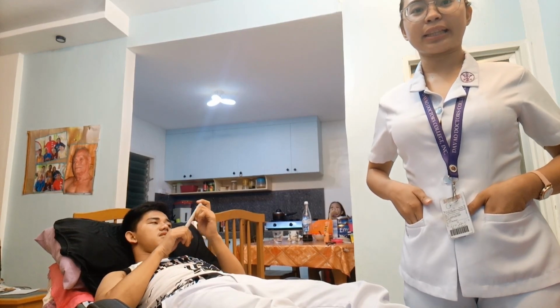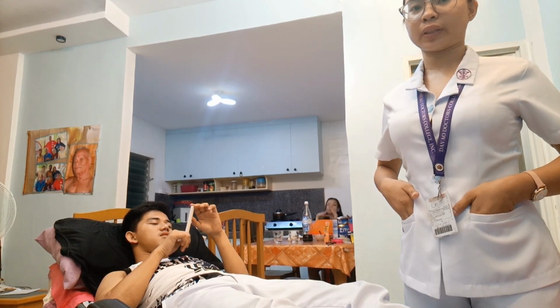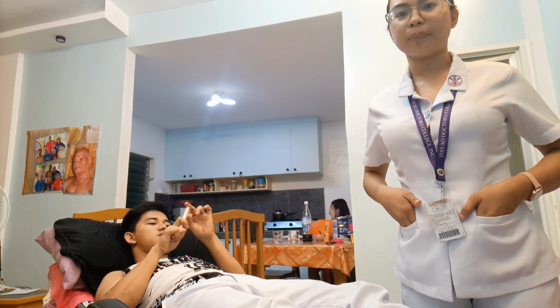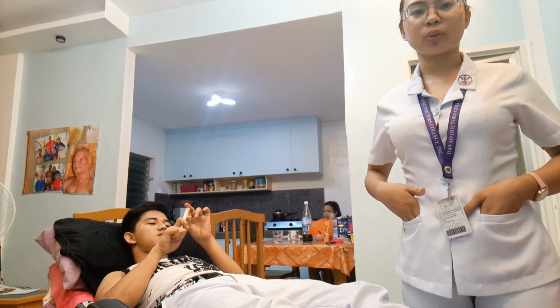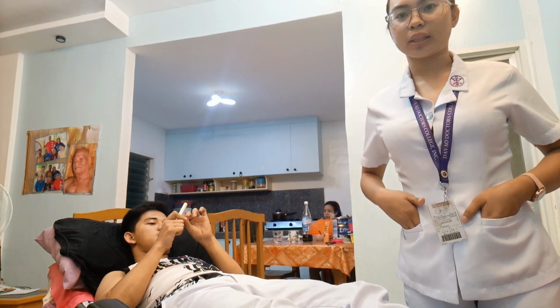Turn the client's head slightly away from the side being examined. Place the bell of the stethoscope over the carotid artery. Ask the client to hold his breath for a moment and auscultate the carotid artery, listening for a bruit, a blowing or swishing sound caused by turbulent blood flow through a narrowed vessel, which is indicative of occlusive arterial disease.